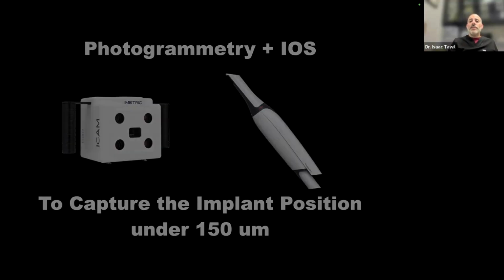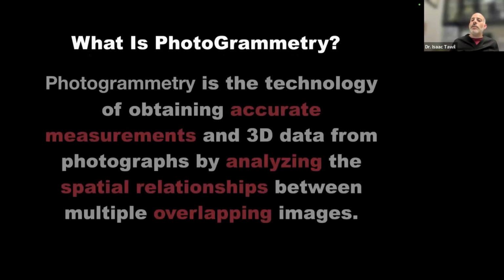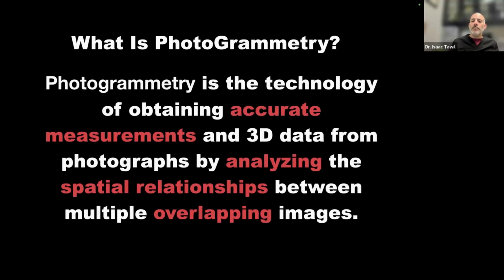So if we do these types of cases, when we employ photogrammetry, we have to start to understand what photogrammetry is. So photogrammetry is an industrial solution, and it is used for accurate measurements of known objects.